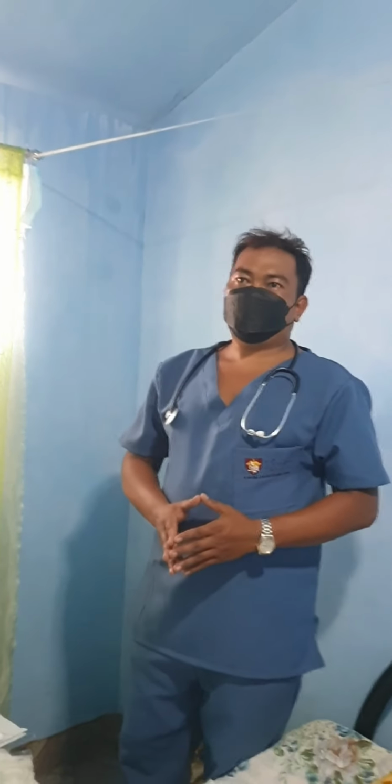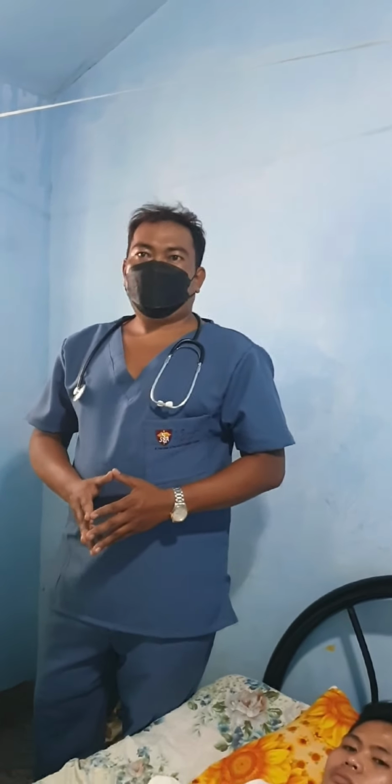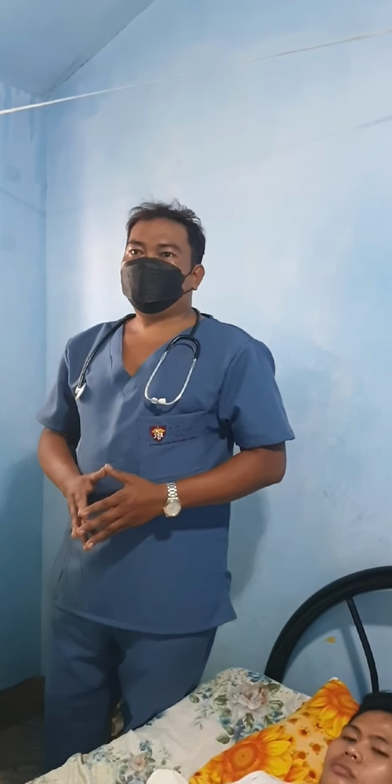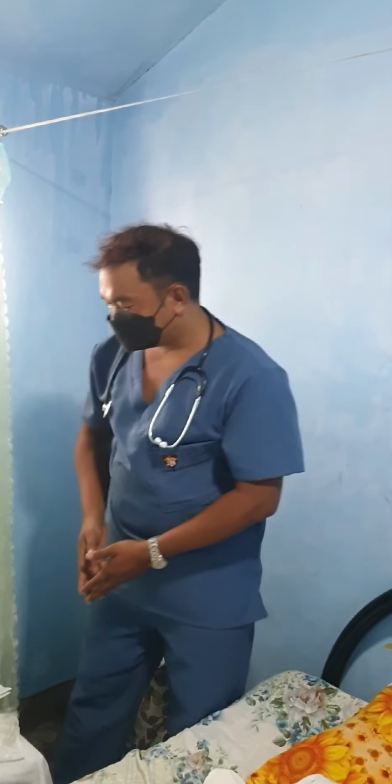The procedures we need for inserting the NGT tube include safety considerations. Perform hand hygiene, check for additional precautions, introduce yourself to the patient, confirm the patient ID using two patient identifiers, for example, name and date of birth.